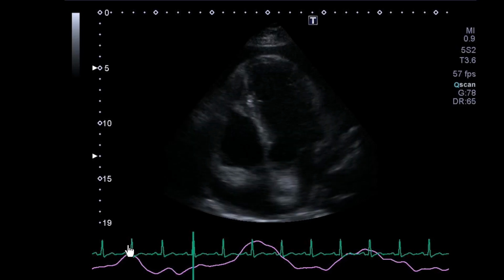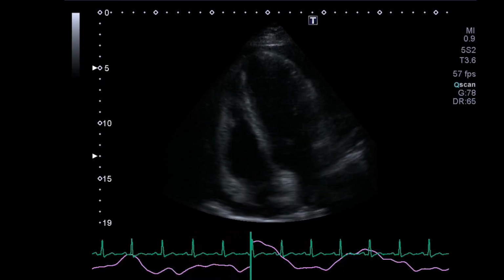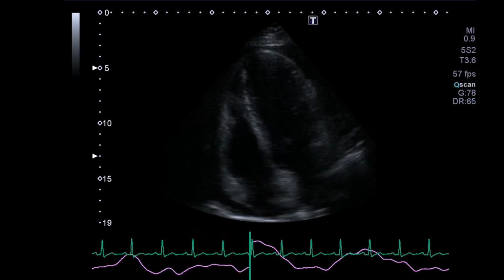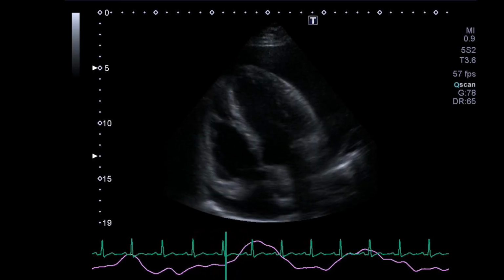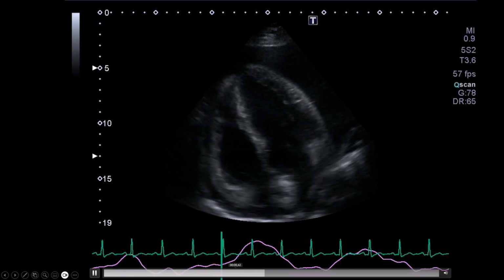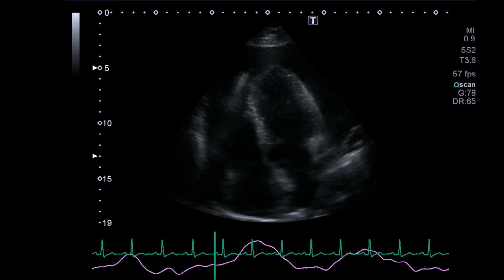In this four-chamber view, which was taken a little later, about 30 seconds or so, you can see a little more of this swinging heart. This gives us a little more of this impression. But of course, you also have to bear in mind that the probe handling is not so easy in this case. Rather, with so much dynamics, we certainly come out of the axis a little bit. We also know this phenomenon from foreshortening when we want to determine the EF of the left ventricle. So you always have to be a bit careful whether it's really that extreme here or not.